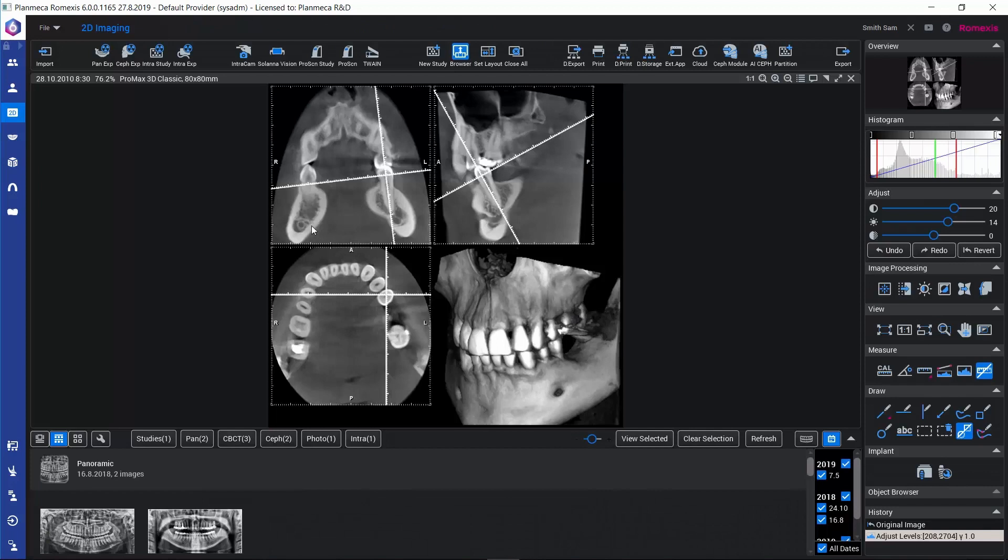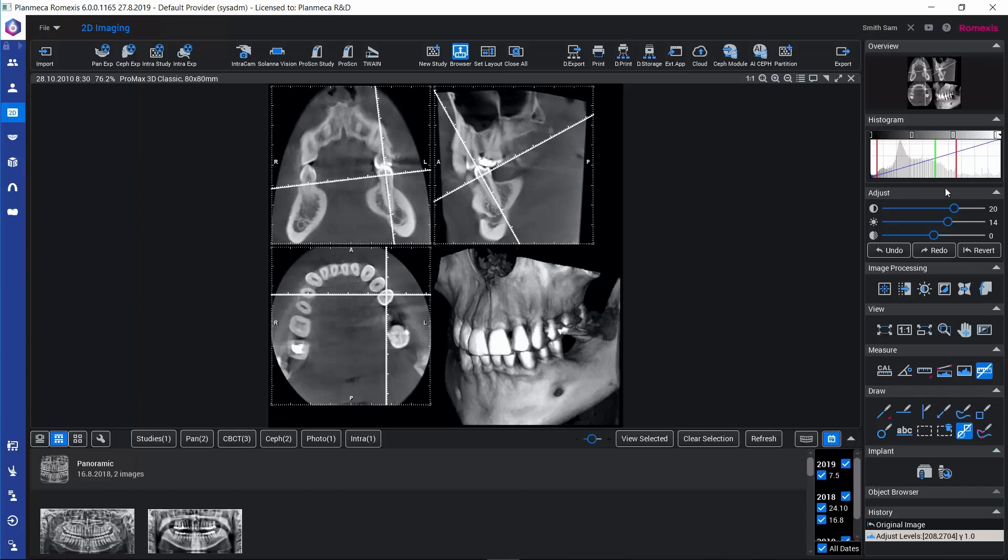The 2D snapshots get saved here in the 2D module for the patient. We can find this one here in the CBCT category. And as I said, now we can continue working on the image with the 2D processing tools.